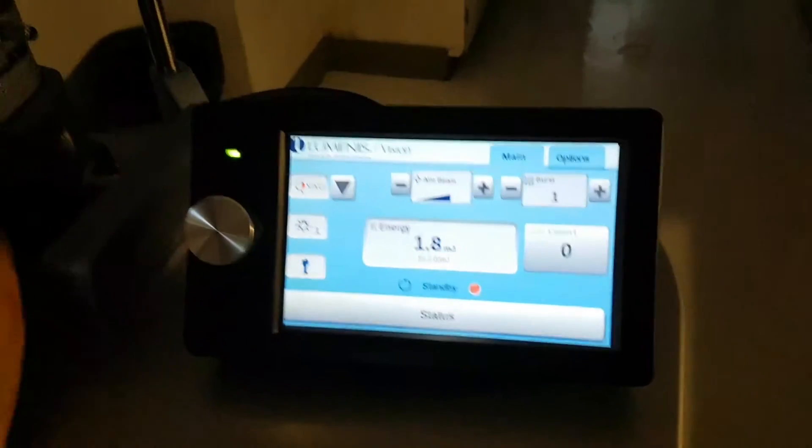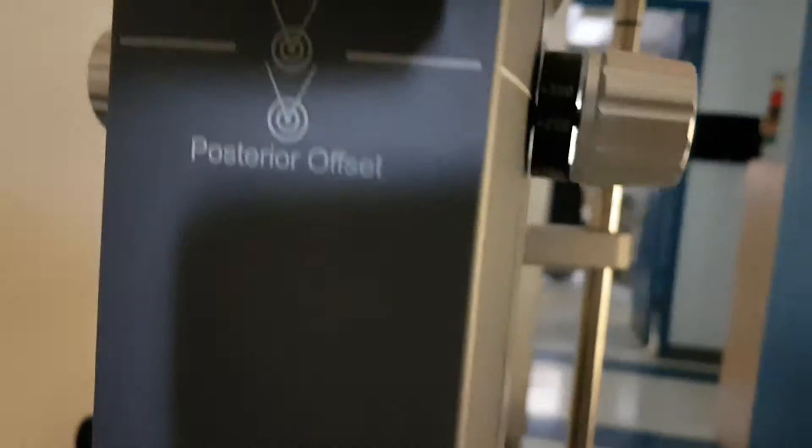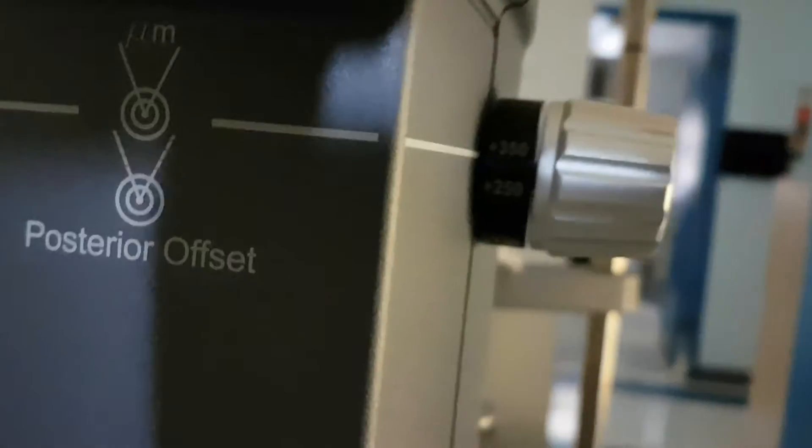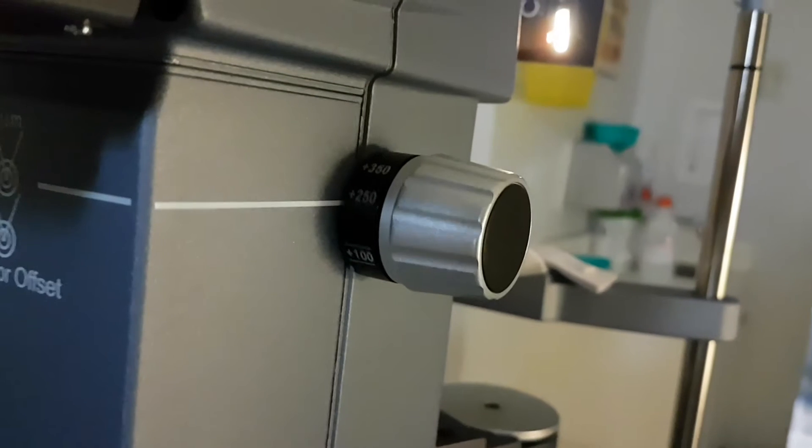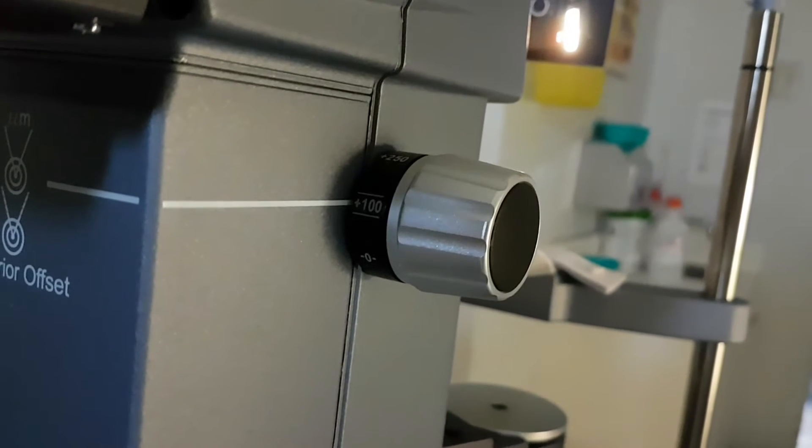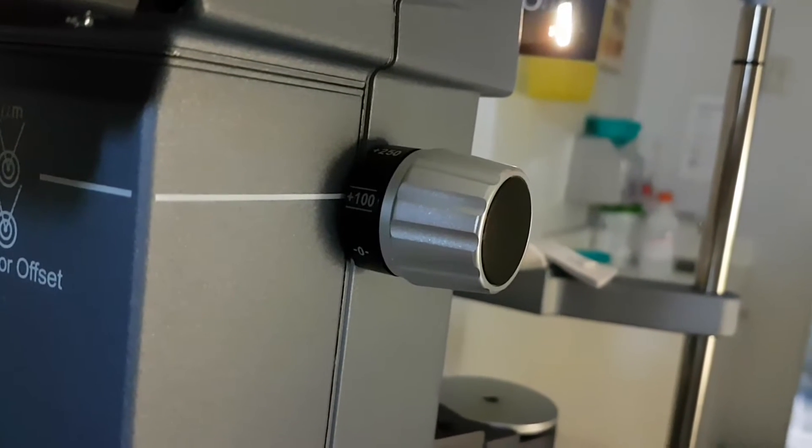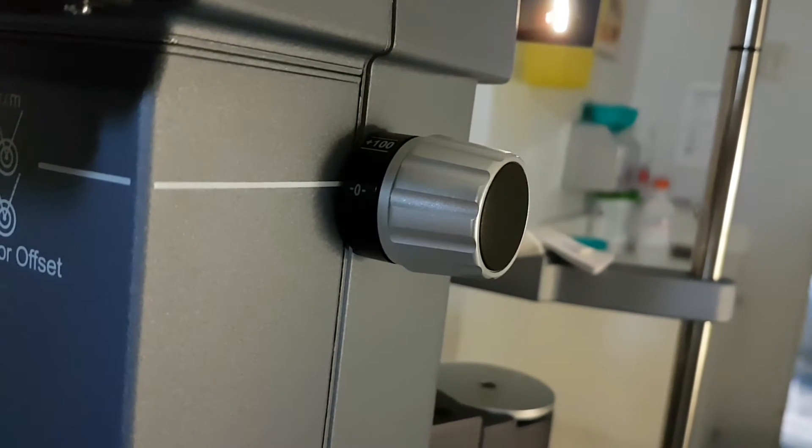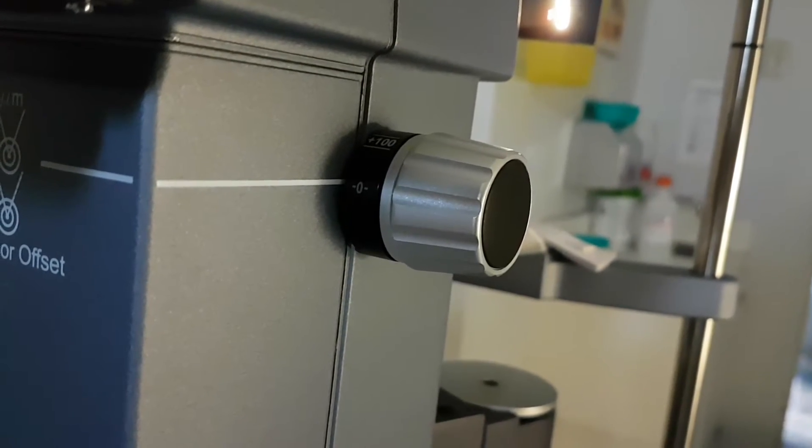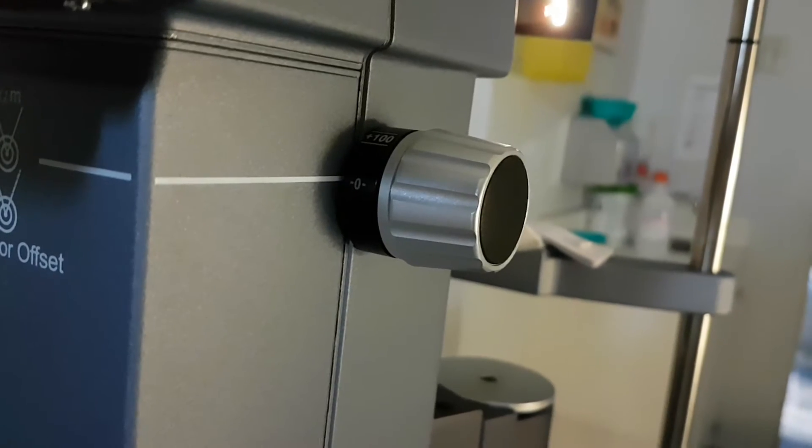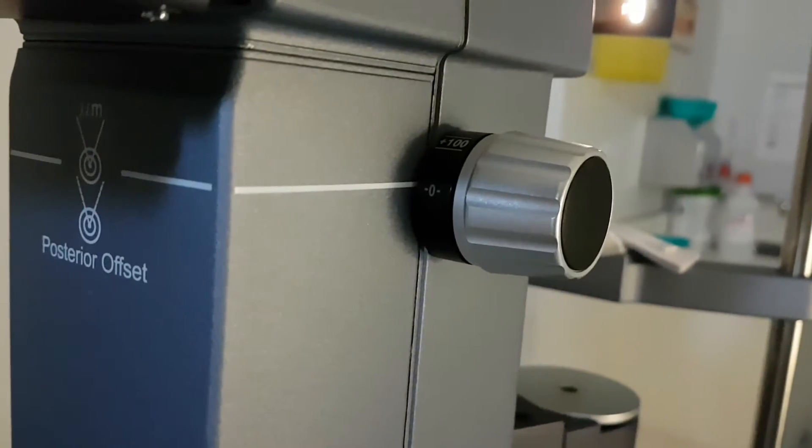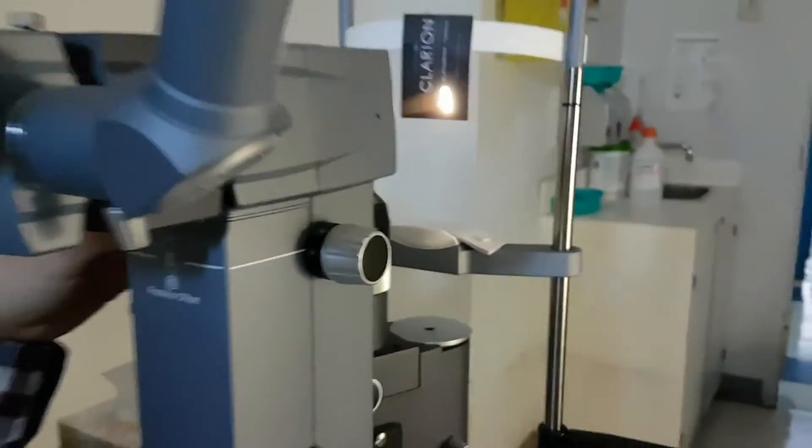Anterior and posterior offset right here. So this is now set at plus 350. We typically don't use an offset of more than 250, and most commonly used is plus 100. If you put it at zero, there is a safety posterior offset of 100 microns built in.